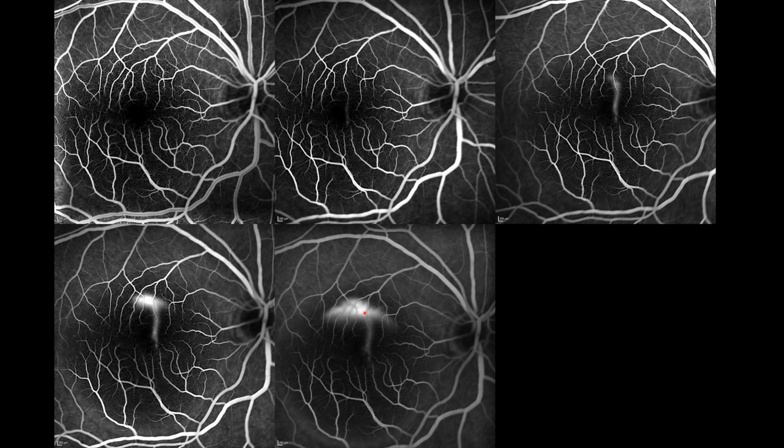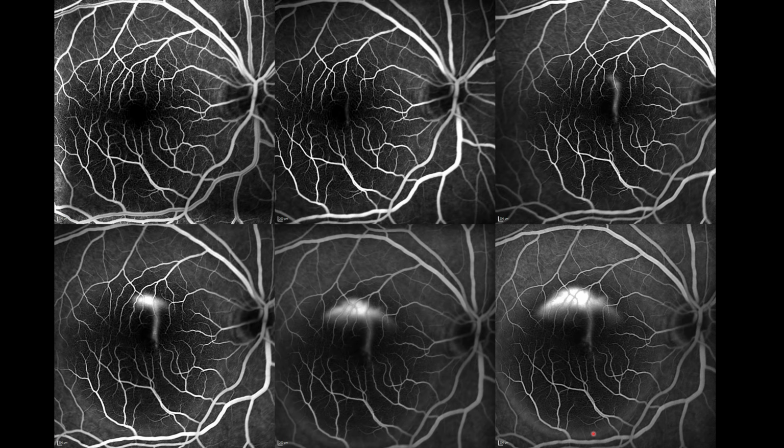So this is the leak site, and from this leak, whatever fluid is coming into the subretinal space is now getting localized in the area of the detachment. And here you can see that white area becoming even more white, which is a classic sign of pooling, that you will have an increase in hyperfluorescence. That means it will become more white, but you can easily make out the margins are not changing.